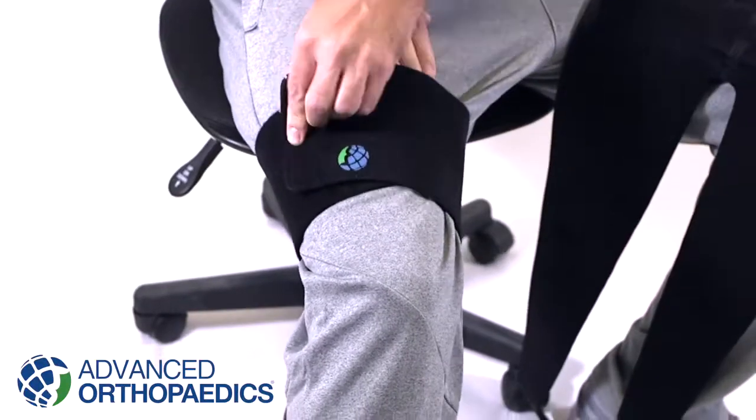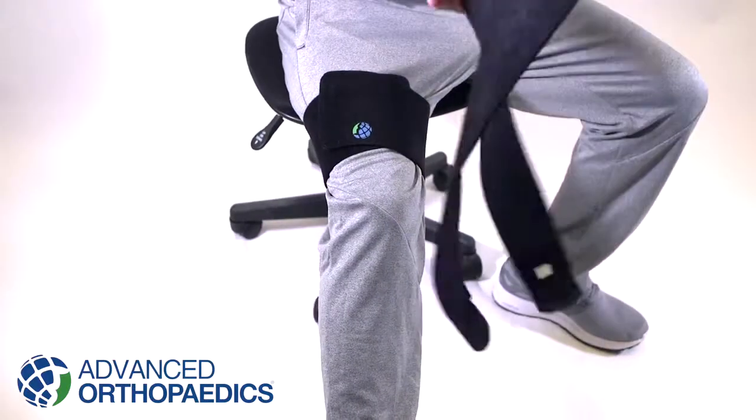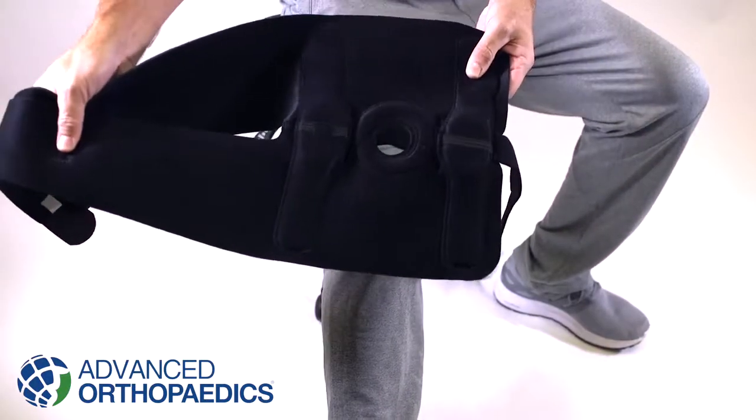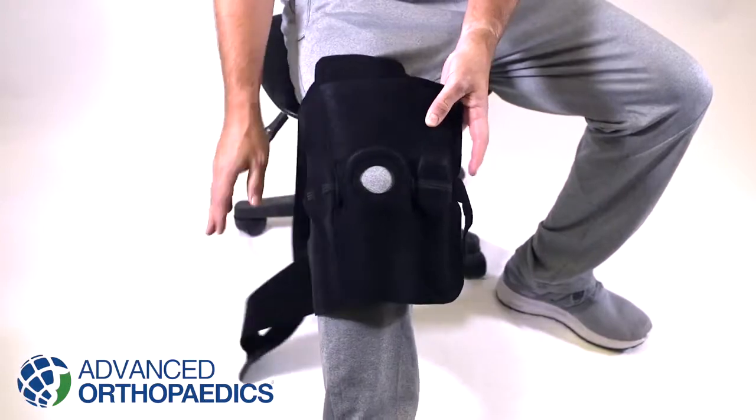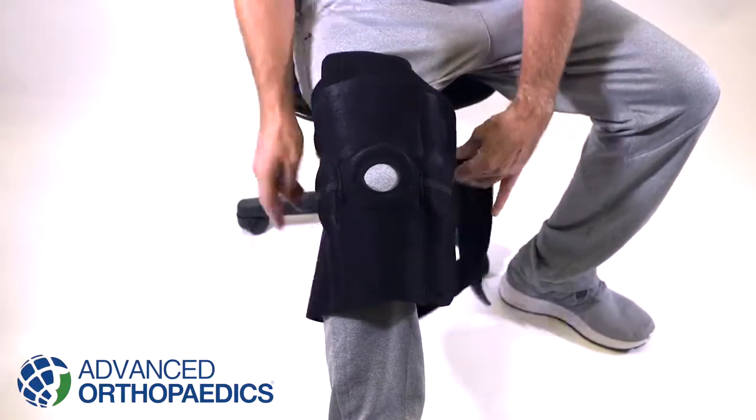This brace can be worn with the optional FastFit sleeve. This universal fit sleeve prevents the brace from sliding and moving with wear. Place the brace around the knee so that the hinges line up with the center of the kneecap on both sides of the leg.